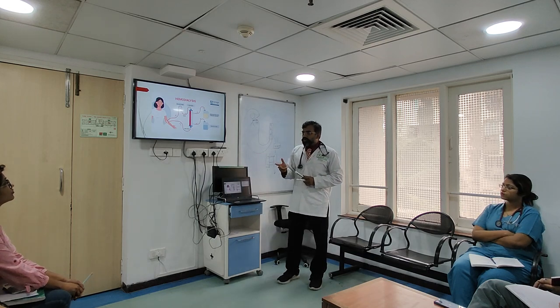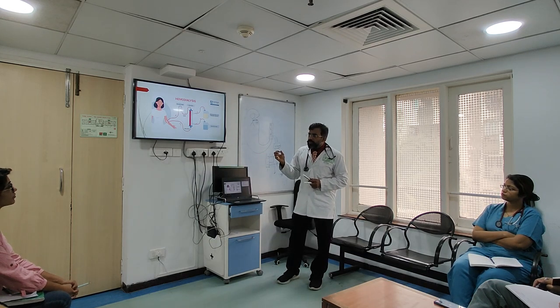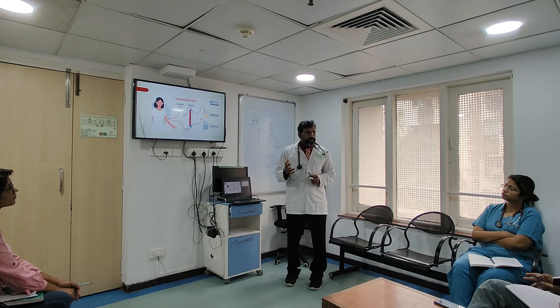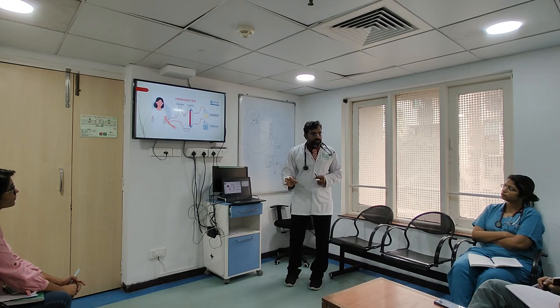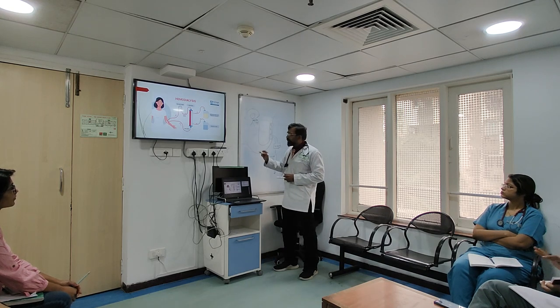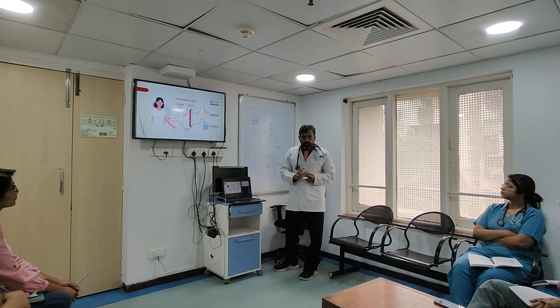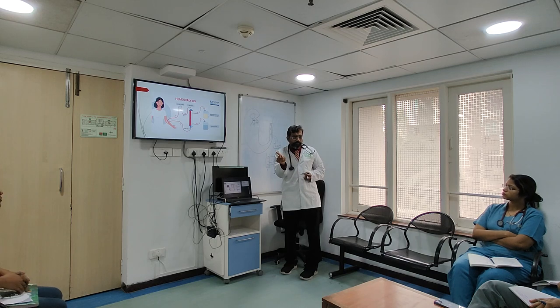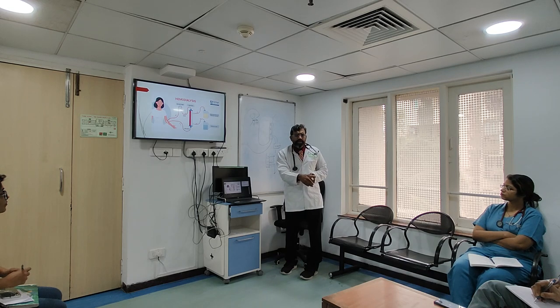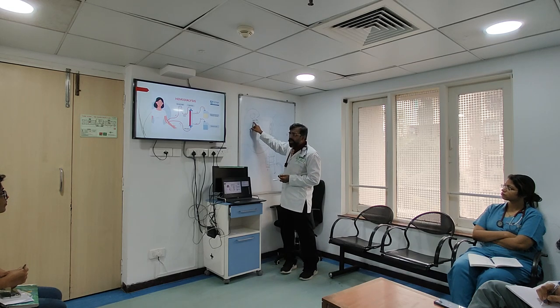Now, the roller pump is very important. The roller pump is responsible for pulling in fluid and pushing fluid, both. It is responsible for pulling and pushing it through the filter. That is why you have a pressure gauge shown over here. In your machine, you should see what is coming from there and where my pressure gauge is reading. Classically, that pressure will be negative, because it's pulling fluid. So how negative can you go? You cannot go to minus 280. It tells you that there is a problem in the access here.